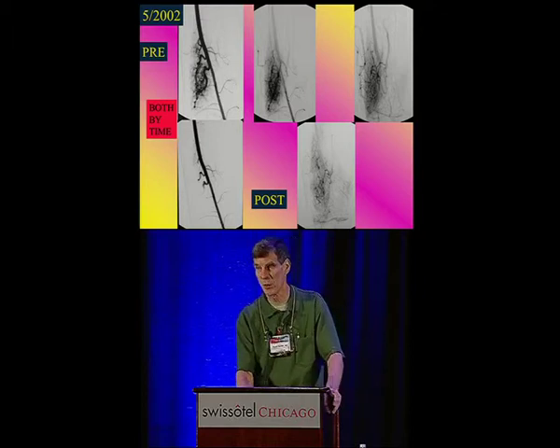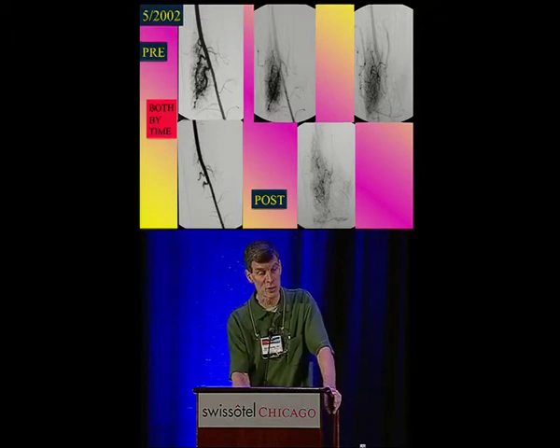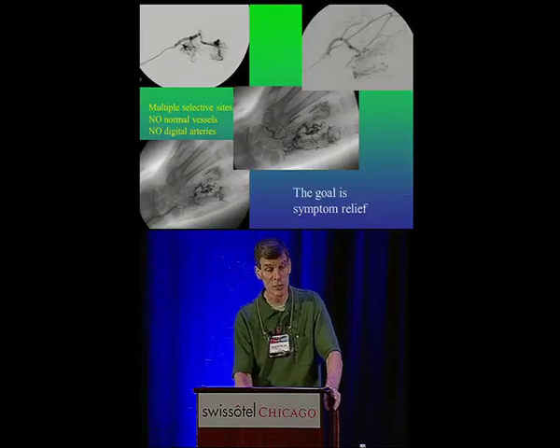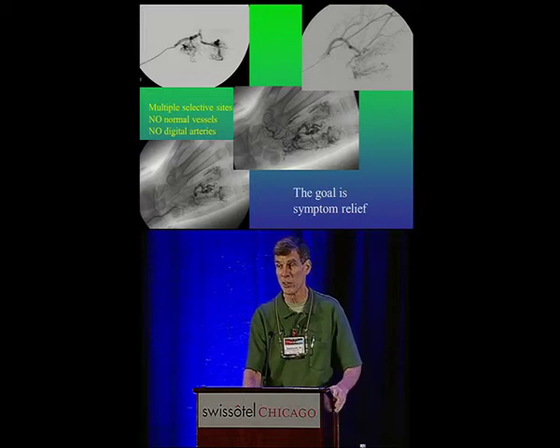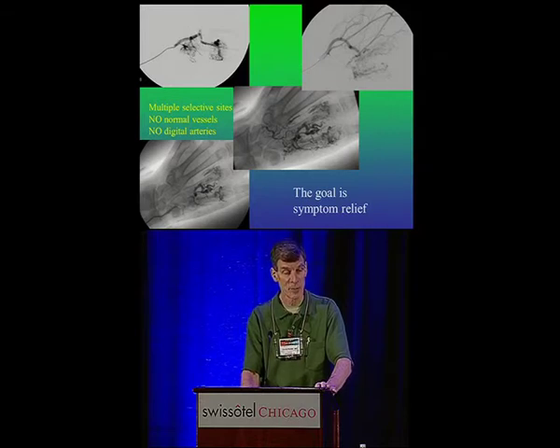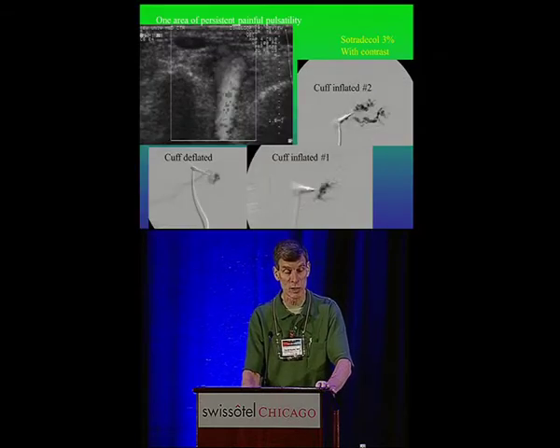So there's a certain amount of revascularization that occurs no matter how hard you try. That's one of the reasons that we've been switching in a lot of these to the combinations of sclerotherapy and glue. This was a hand malformation where we put a lot of glue in about 3 or 4 different sessions, trying to make sure we didn't occlude any arterial flow, just abnormal vessels. And you really have to make sure you're only in abnormal vessels.